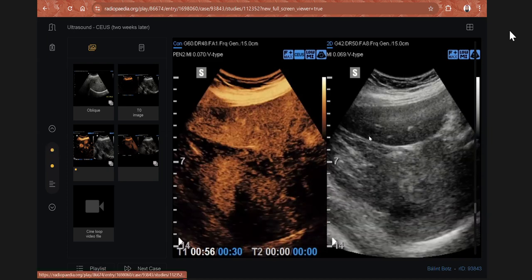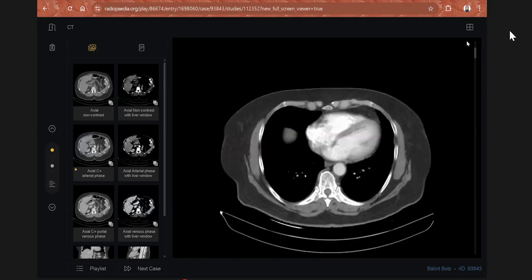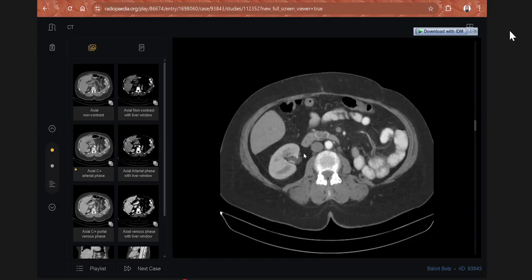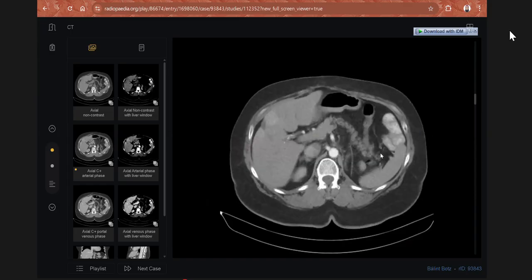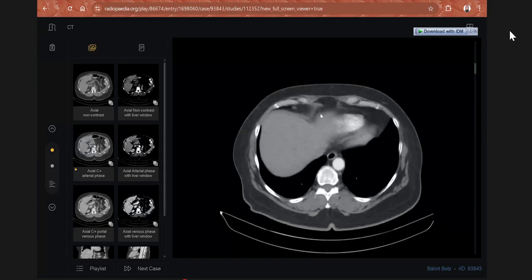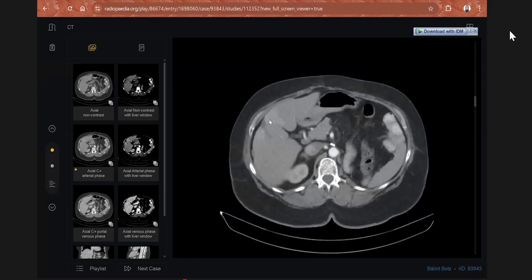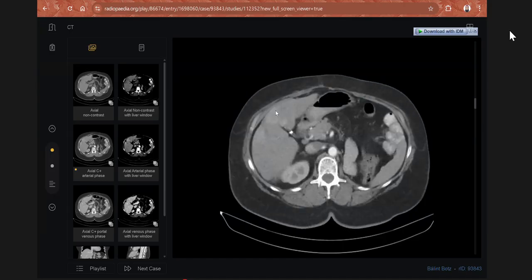So okay, very good. You picked that arterial enhancing lesion, the liver was normal, and the washout, and the kidney left side nephrectomy, and again right adrenal lesion, good. So maybe a renal mass with arterial enhancing hepatic mets. Yeah. So you have to refer to MDT. If previously known, then they will know, then change the regime.